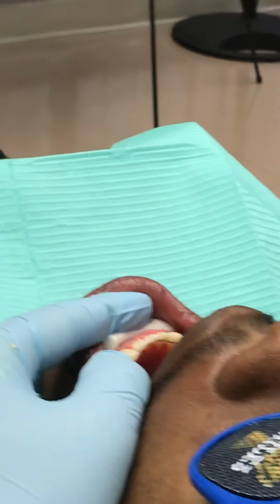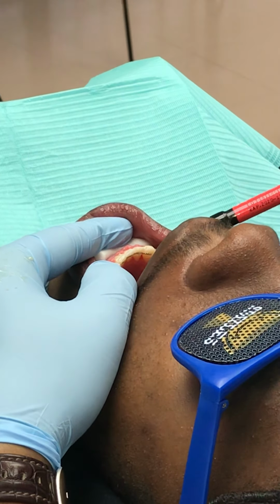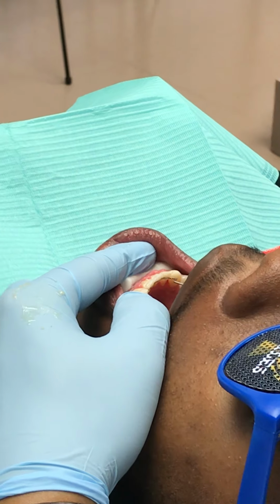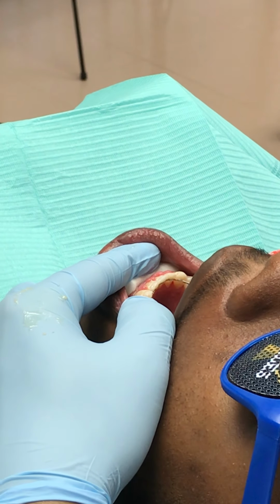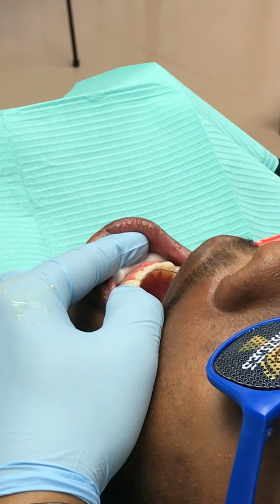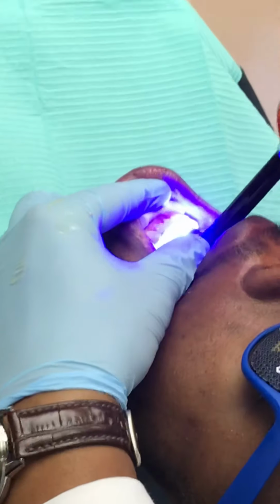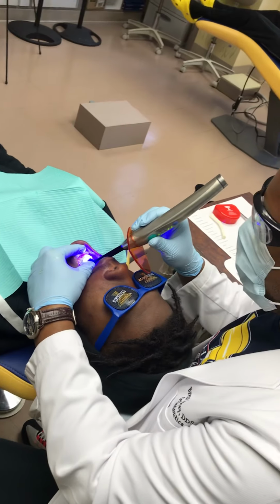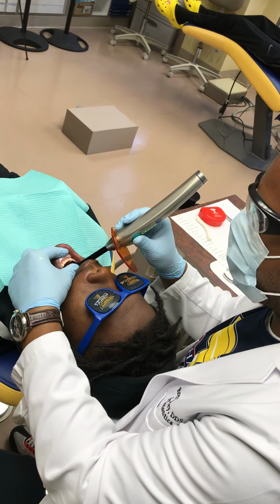So this is going to be a good fixed retainer that should last him a long time. It's going to be very low profile, so he's not going to feel like he has something in his mouth, not something really big. A lot of times when you see fixed retainers, they're really big and bulky, and there's lots of adhesive, and that can be annoying to patients. And also, it's going to be very hygienic because it's low profile and because of its positioning of the wire and the application of the adhesive. So all of these are important in terms of the quality of the fixed retainer and in terms of the longevity of the fixed retainer, how well it will last and how good of a job it will do.